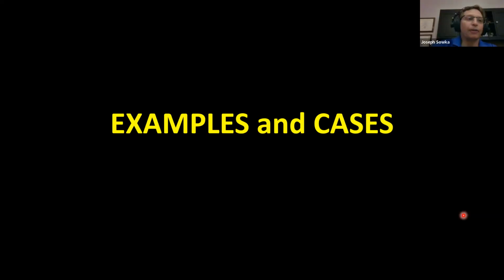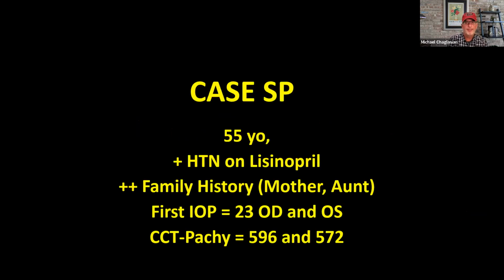And in those anomalous nerves, the question is the field loss congenital or acquired? Yep. We all have those patients where we just don't know if we did the right thing. But I don't generally keep doing OCT on them a lot, but anyways.